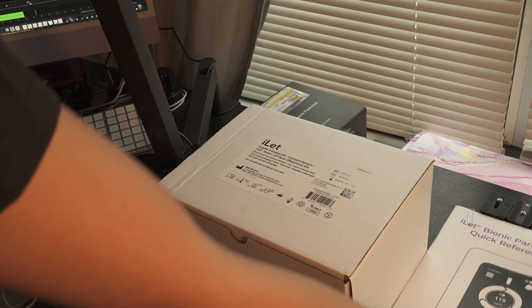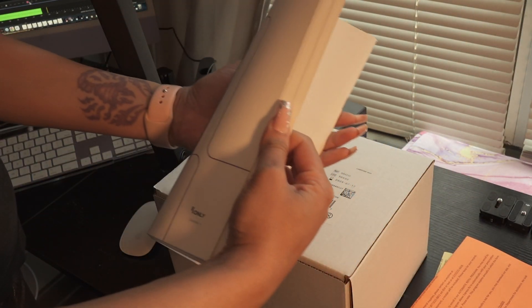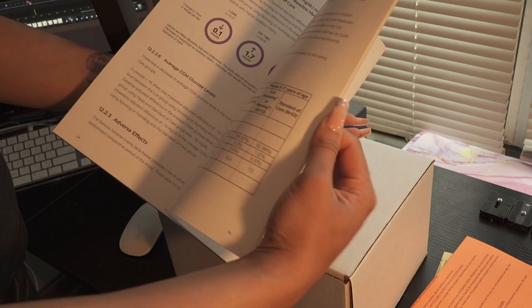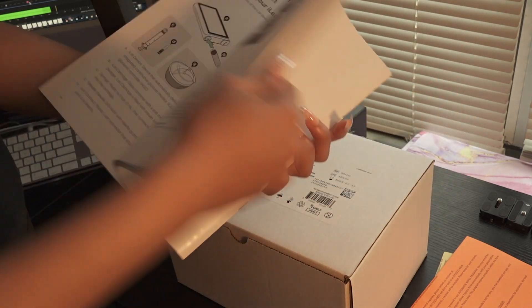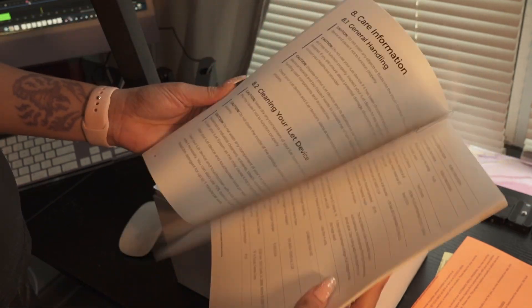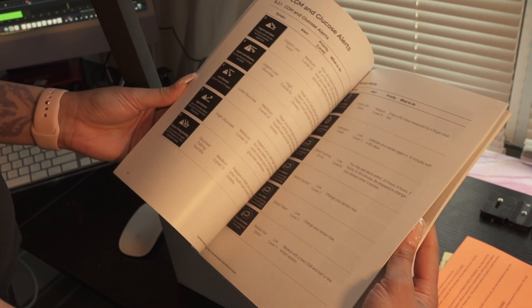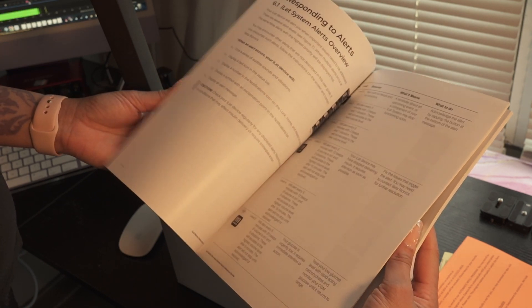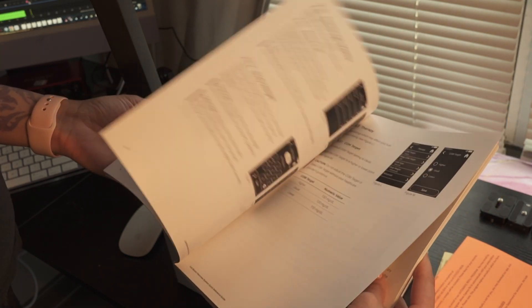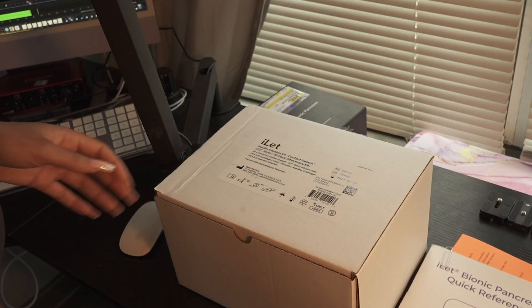It came with this quick reference guide. I don't know how quick they thought this was, but it's a doozy. It's less than 100 pages, so I guess it's not that bad, and the print's kind of big. It tells you different things about the iLet, how to connect your CGM, how to clean it, how to insert new insulin cartridges, and the tubing and all that good stuff.